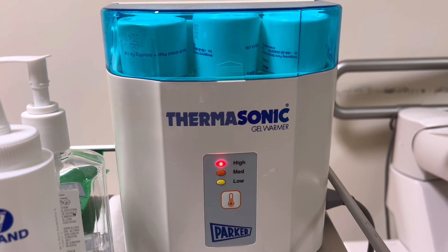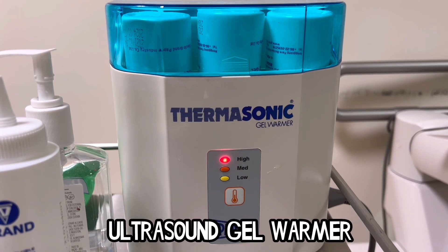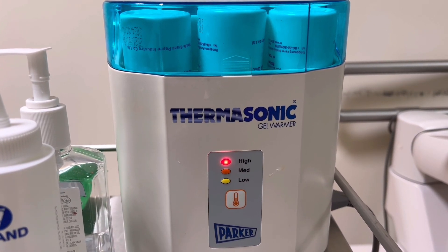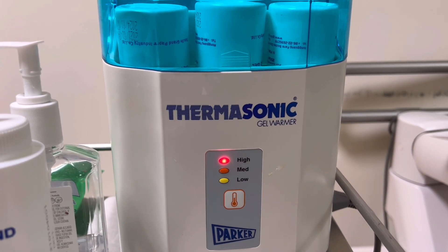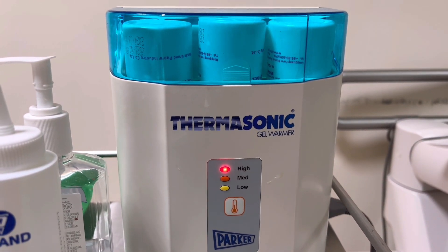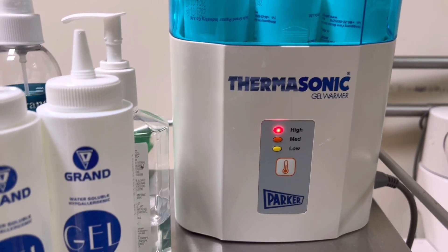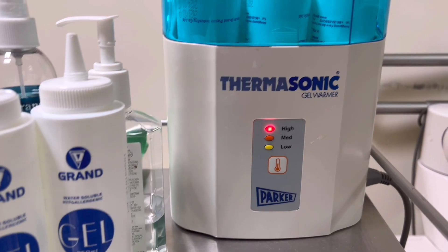Next is a device called an ultrasound gel warmer. It is made to maintain a warm temperature in bottles of ultrasound gel. Its purpose is to make patients more comfortable, and these ultrasound gel warmers are simple to use and are available in both single bottle and multi-bottle versions.